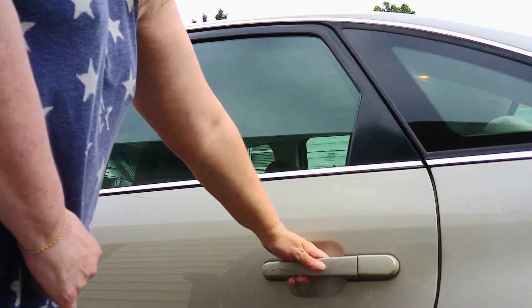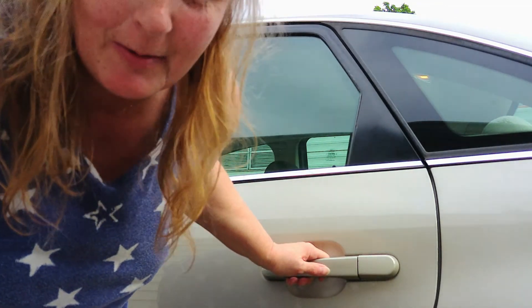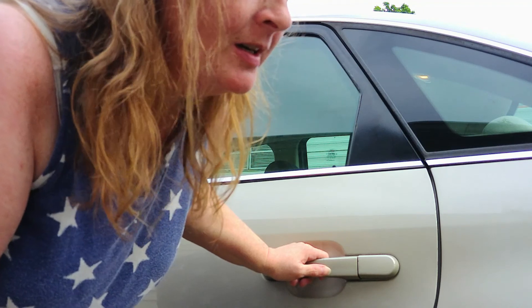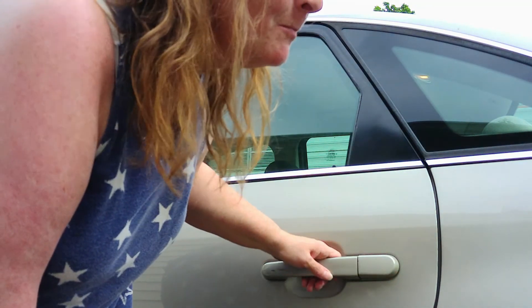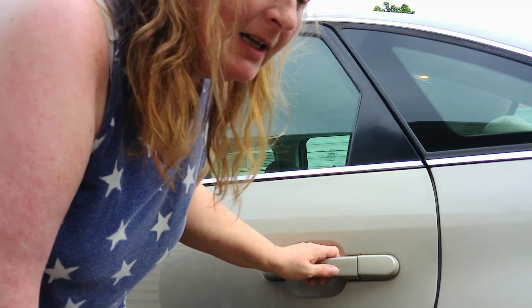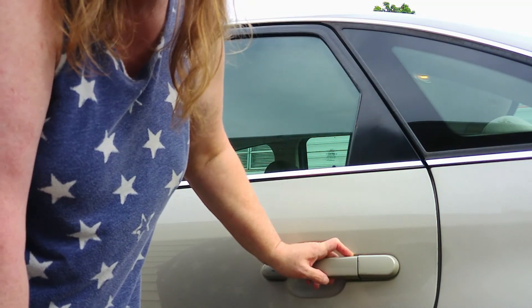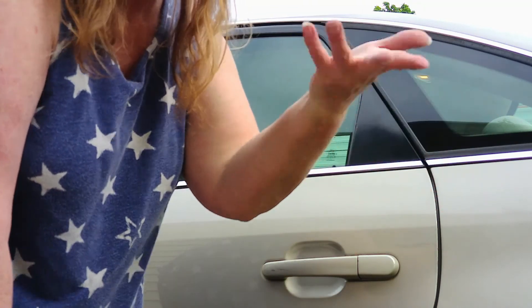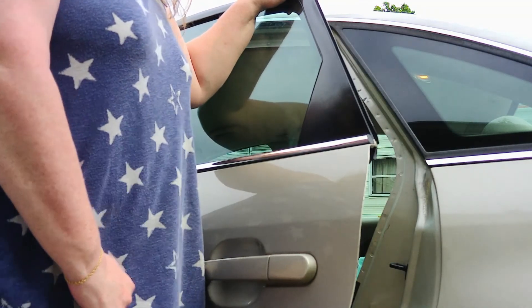As long as I'm here, I'm going to show you how to get your wheelchair in and out of the car. I'm going to do that now. Go ahead and open up the door.